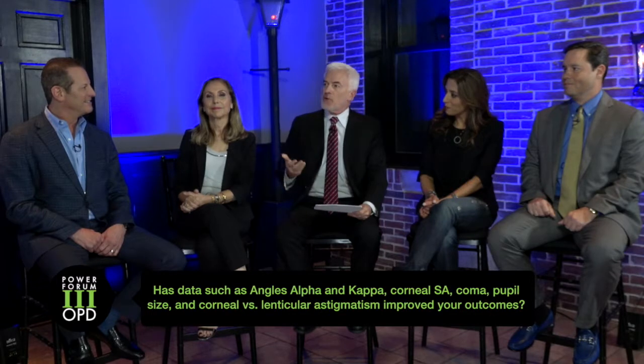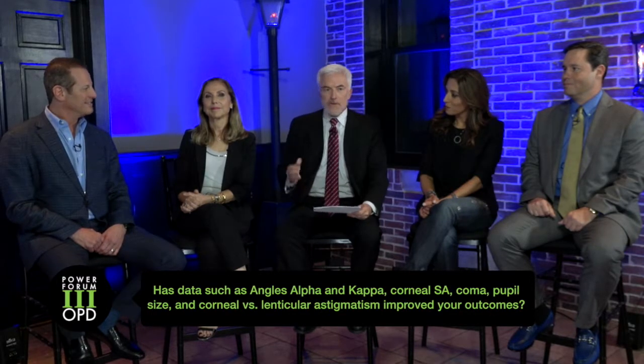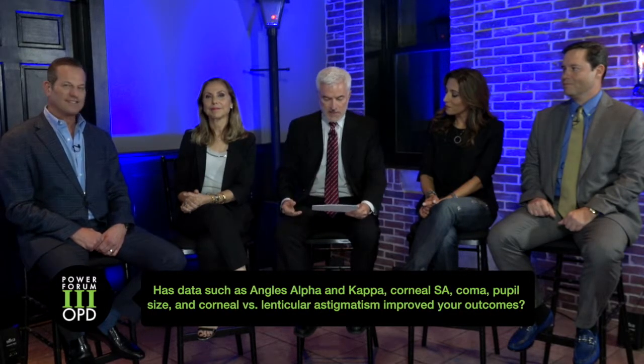Mitch, I've got a question for you. There's a lot of information we can get before cataract surgery, and there's evidence that certain data points, things like angles Kappa and Alpha and spherical aberration and coma of the cornea, photopic, mesopic pupil sizes, looking at lenticular and corneal astigmatism. You've got all these things that could be keys to multifocal and toric IOL selection. And what I want to know is, do you use that sort of data set, and has it improved your outcomes? And how do you get all that information?